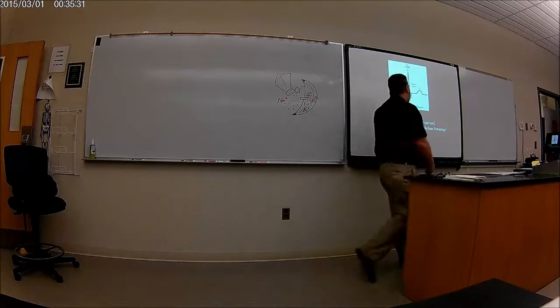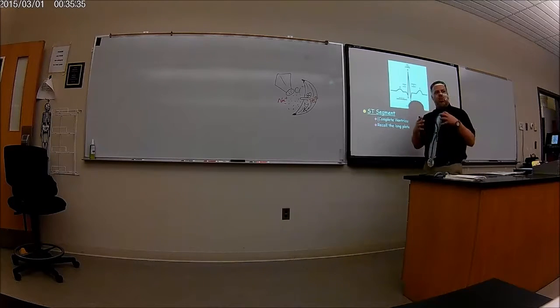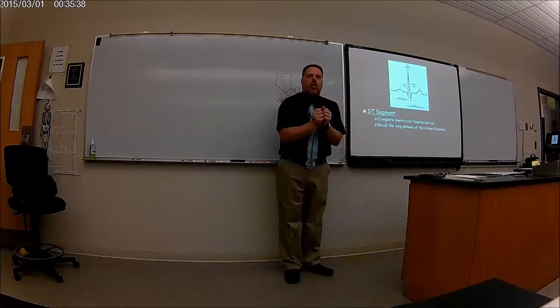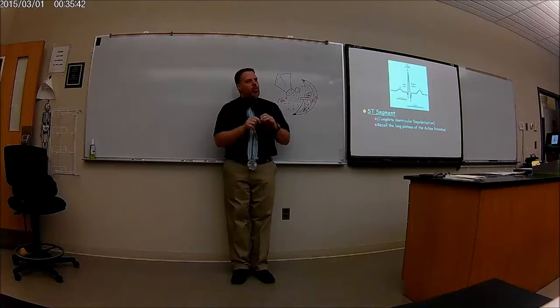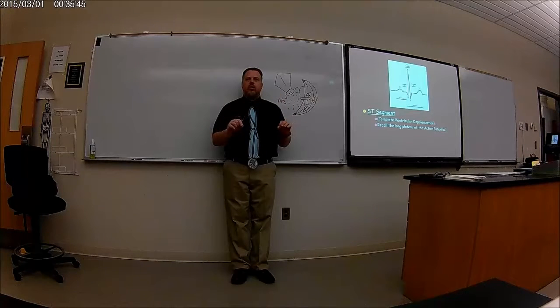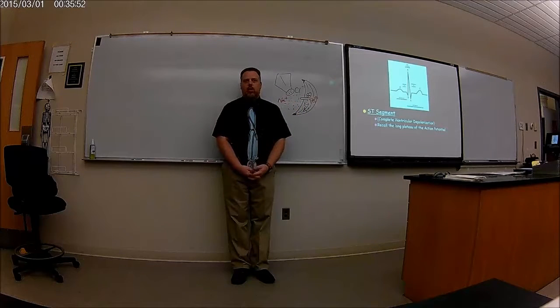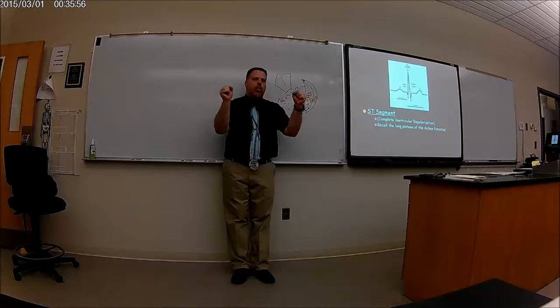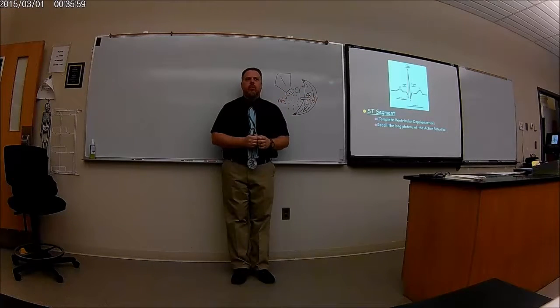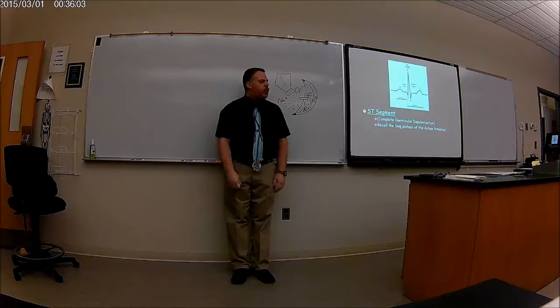Then you have the ST segment, this area right here. This is where you have complete contraction of the ventricles. If you remember, that's the part where the plateau phase is. In someone who's got congestive heart failure, that'll probably be pretty small because it's not going to last that long. So we have medications that will make that last longer so you can have a longer contraction to squeeze out extra blood as much as you could, to make the heart more efficient in congestive heart failure.